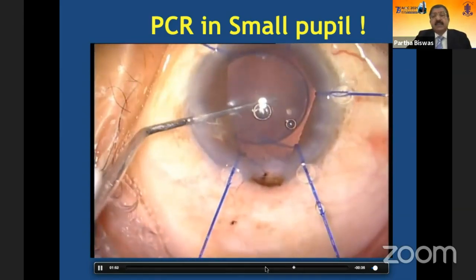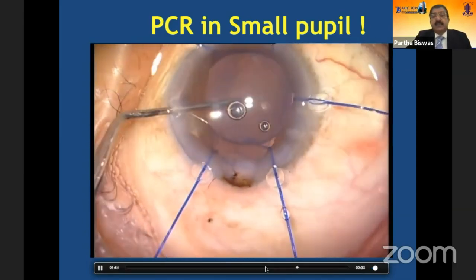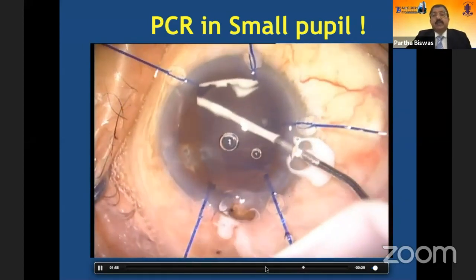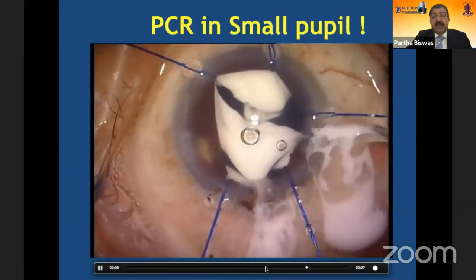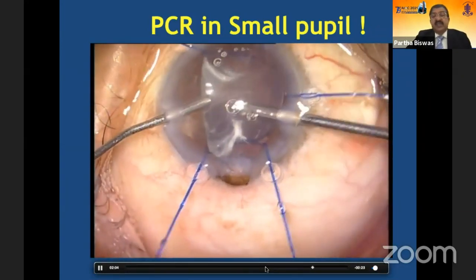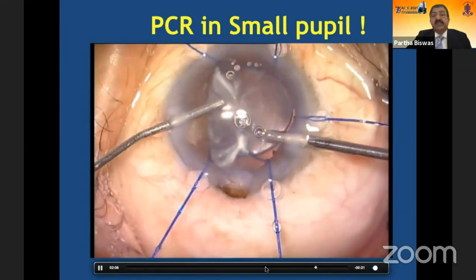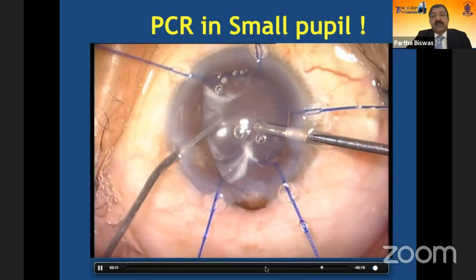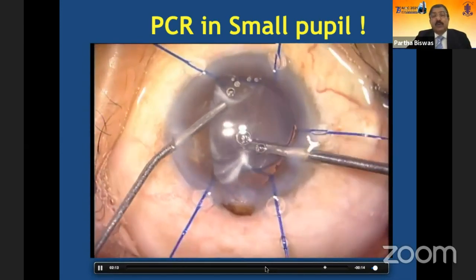And once stable, this is going to stay stable for life. And of course, you can see the ovalization of the anterior capsule as it is captured. So again, vitrectomy, and you can see these strands of the vitreous which become very visible when you put in triamcinolone. And you can see, of course, it's been a very tough situation, 5 hooks all there.